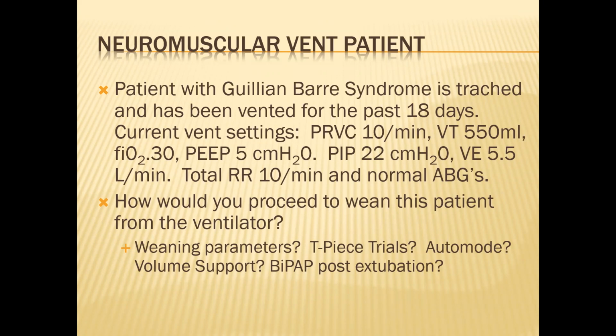So we talked about the T-piece trials. What about auto mode? So that's going back and forth between spontaneous breathing and full support. So PRVC goes with volume support, right? Yes. So it's possible they could just stay in PRVC all the time, not initiate any breaths.